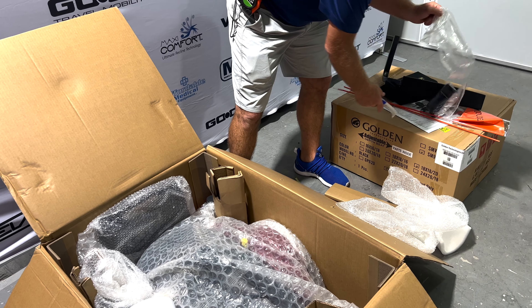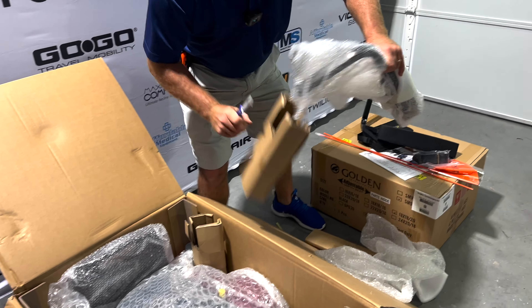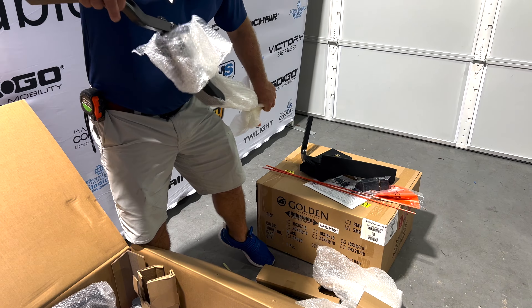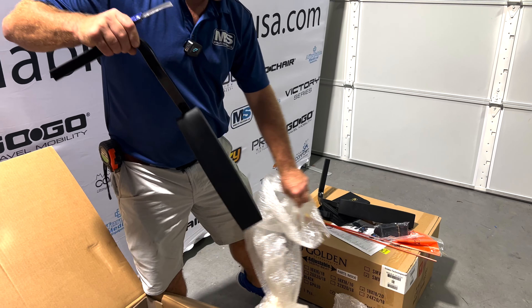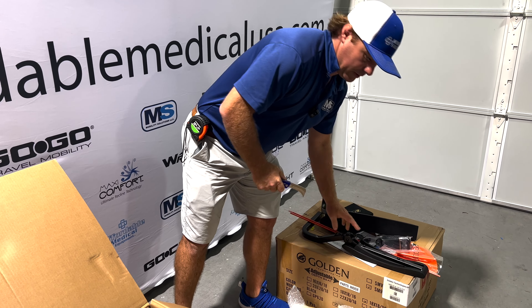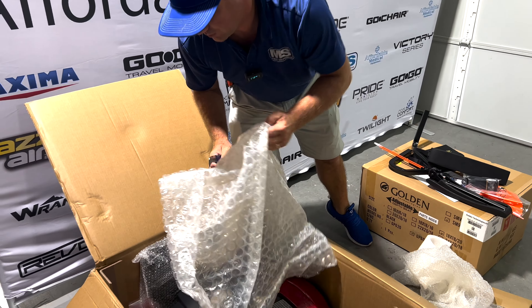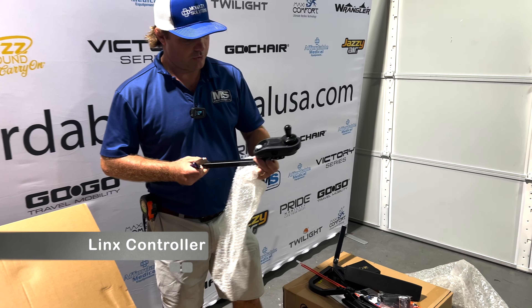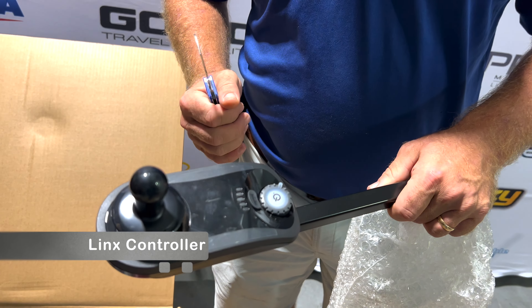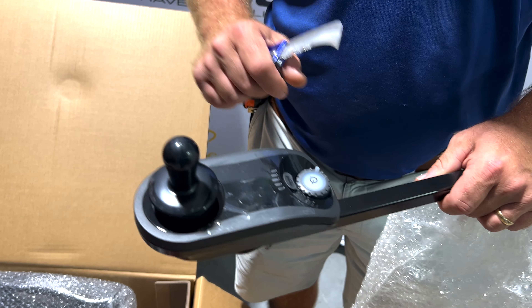That's your seat belt, and we'll show you how that comes on. This is a true mid-wheel drive power chair. What that means is the drive wheels are going to be in the center — directly in the center — which is going to be a little bit more stable. Here's your LiNX controller. You're starting to see these in a lot of different units from different manufacturers. Basically, when you go from a hard terrain to a soft terrain, it recalibrates itself.